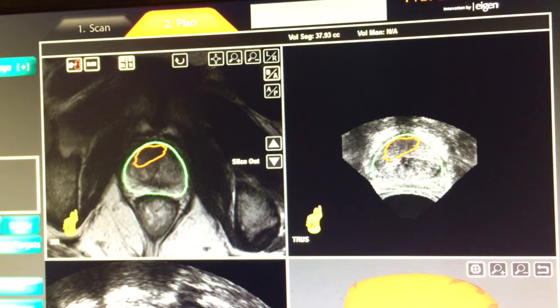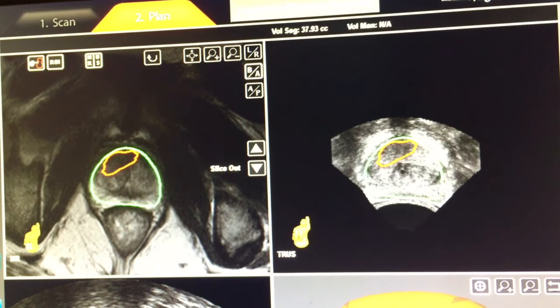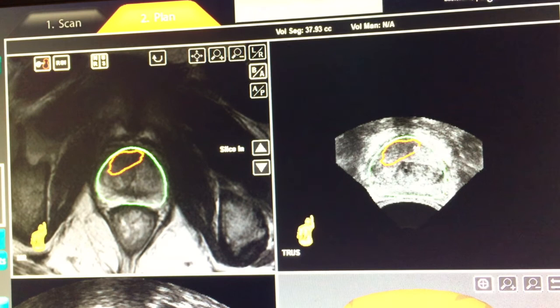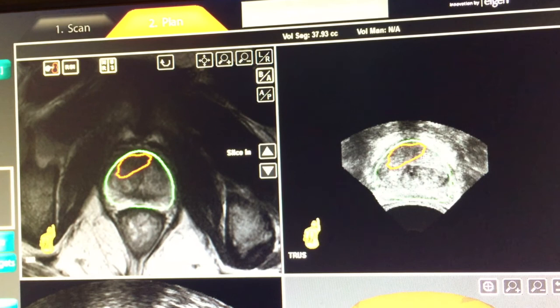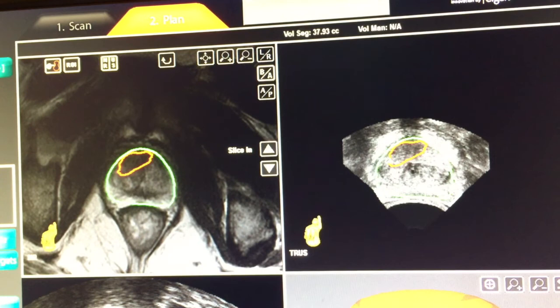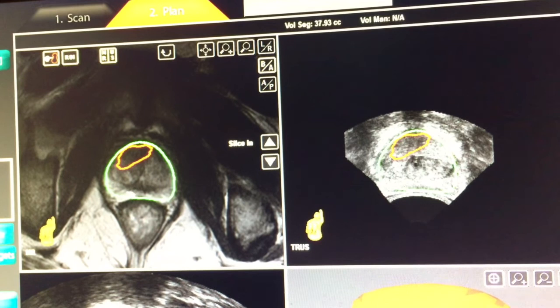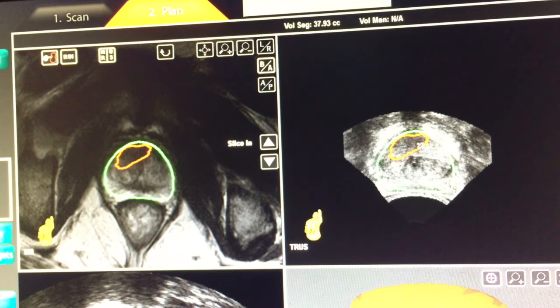Looking at the ultrasound images, the green line is the MRI outline, and you can see how it's matching the ultrasound image perfectly — this is a very precise MRI ultrasound fusion. On the ultrasound image alone, it's not clear that there's a tumor area. However, the red outline maps the tumor as shown by MRI directly onto the ultrasound, and I can use this information to target additional energy to this high-grade tumor area. Without this mapping information, I would have no real idea of exactly where in the prostate this tumor was if I relied only on ultrasound. Using the fusion technique, we map the MRI depiction of the tumor directly onto the ultrasound images, which is how we design our treatment.